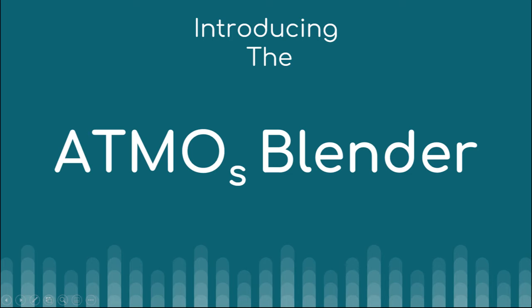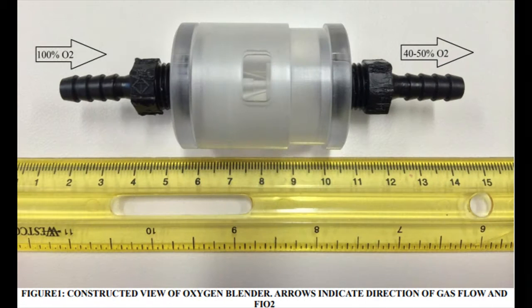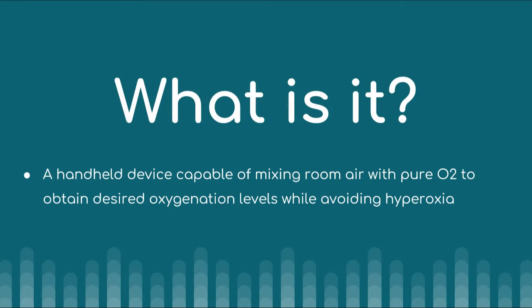Introducing the Atmos Blender, a handheld, lightweight device capable of mixing air with 100% O2 at dialed fractional O2 levels, allowing for better control and decreasing the risk of over-oxygenation.